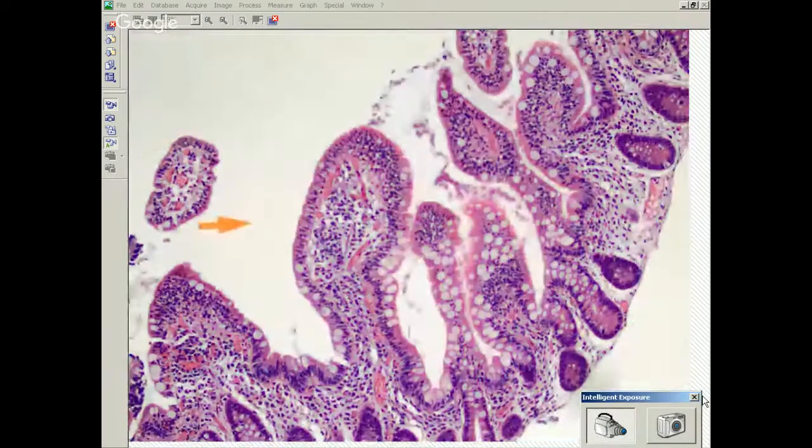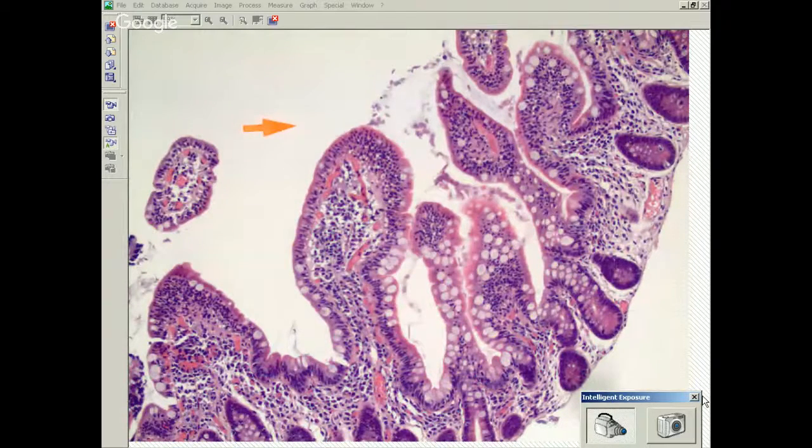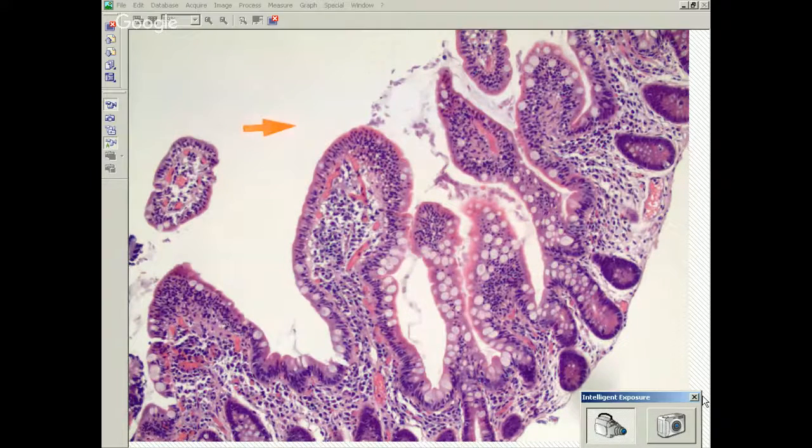And actually, patients with CVID tend to have intraepithelial lymphocytosis, and they also get Giardia. So that's something that should also be high on your differential. You can't just stop at Giardia. You should also look for the plasma cells to get a sense of whether this could be CVID as well. Okay. I think that's it. So let's move on to the next case.